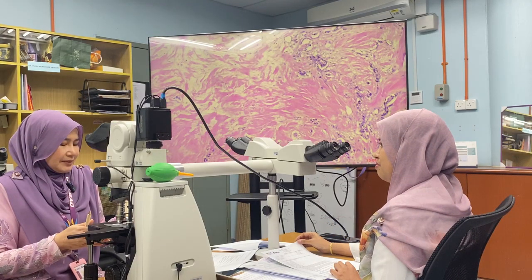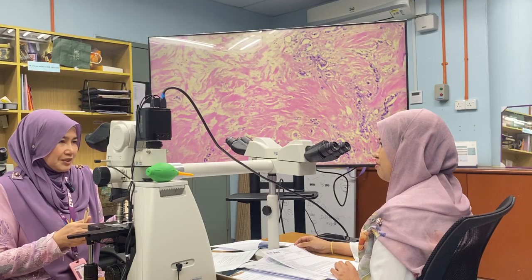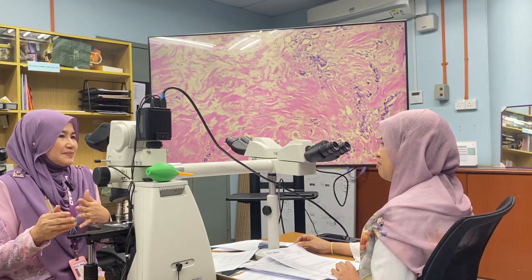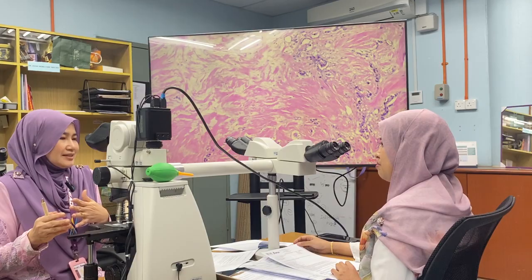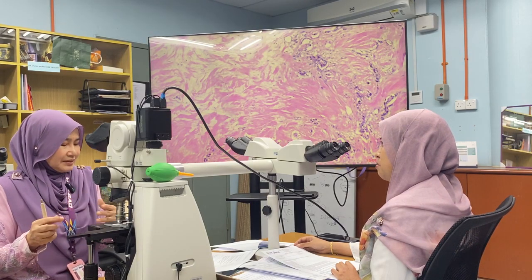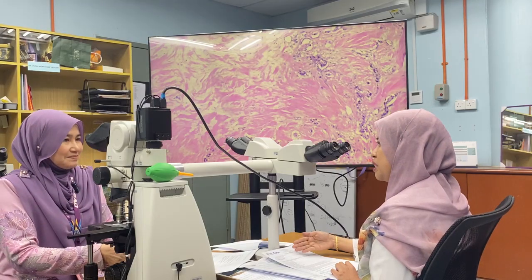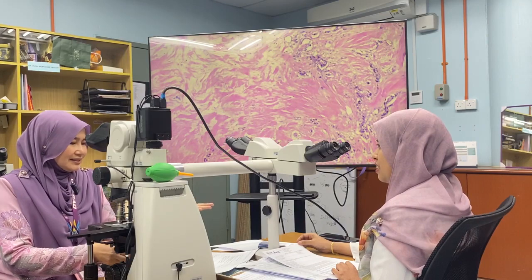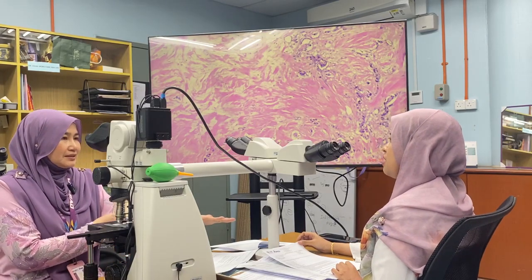So, meaning that the pathology appearance post-chemotherapy, is it only fibrosis? I think we have many other changes that lead to pathological changes in the appearance due to chemo. Is it on gross specimen or microscopy? Gross, as well as translated to microscopy.